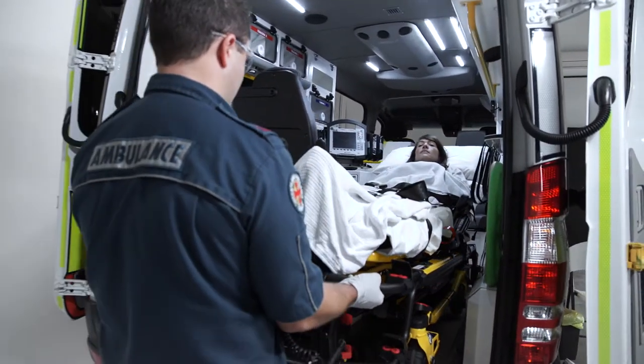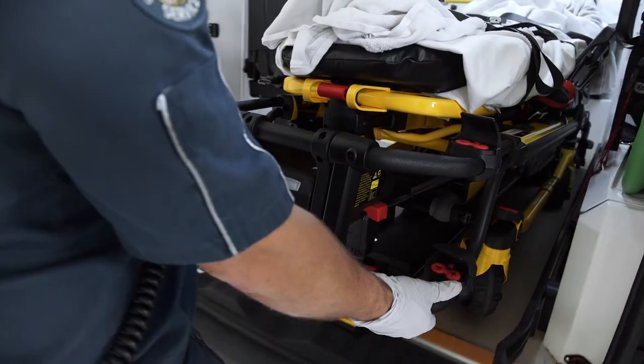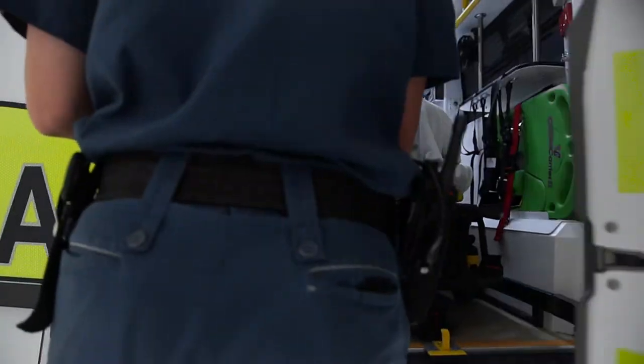Statistics show patients are getting heavier, and the PowerPro XT allows operators of almost any size to raise, lower, or load the stretcher with less spinal load, reducing the risk of injury.